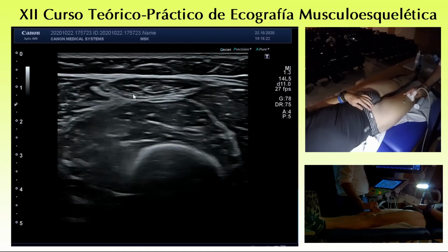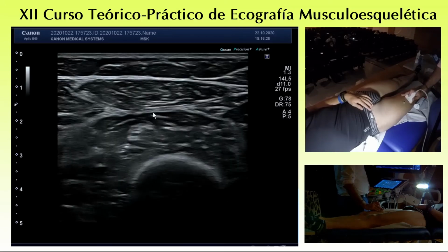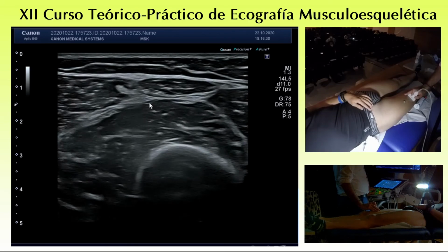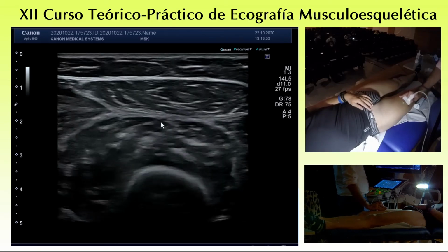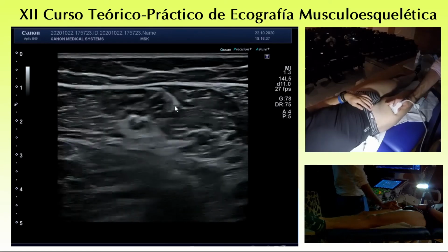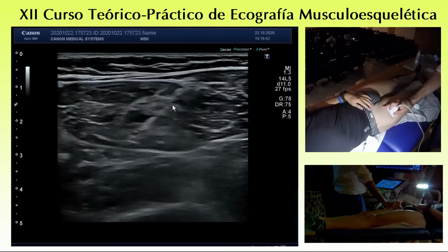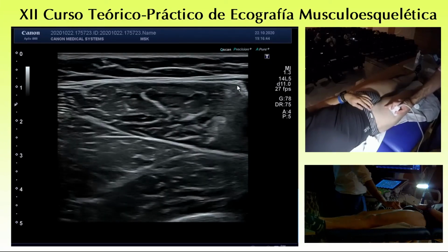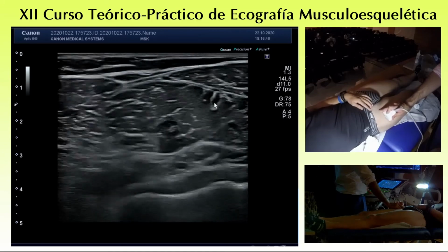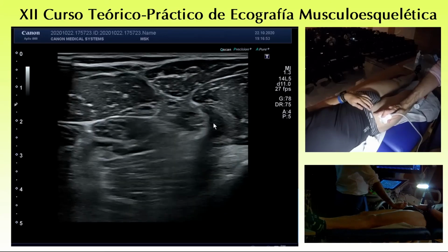You see the most distal aponeurosis of the rectus femoris with the myotendinous junction, in common with the vastus intermedius. So yes, it's really a complex muscle where you can have different types of injury, and it occurs more commonly along the central septum, which is a real myotendinous junction for the indirect bundle. Okay.